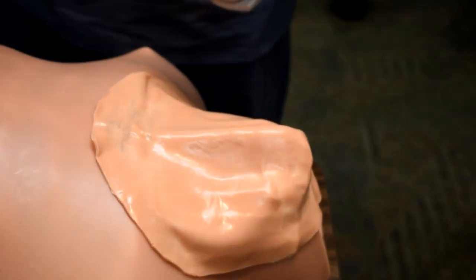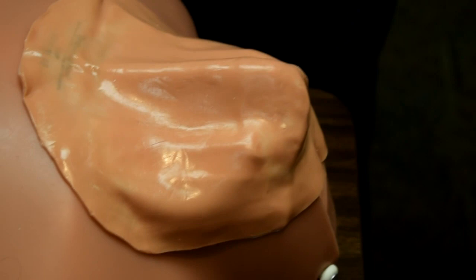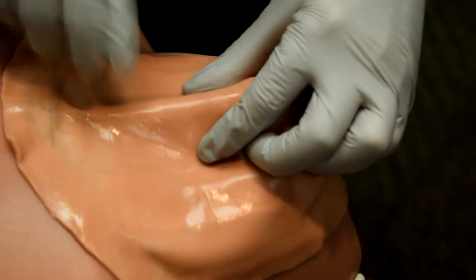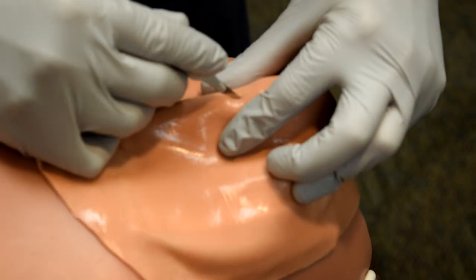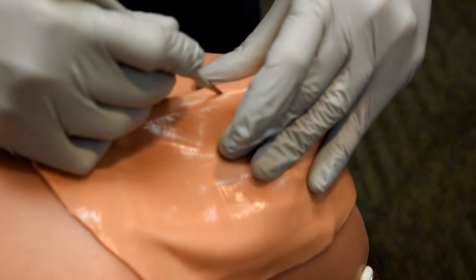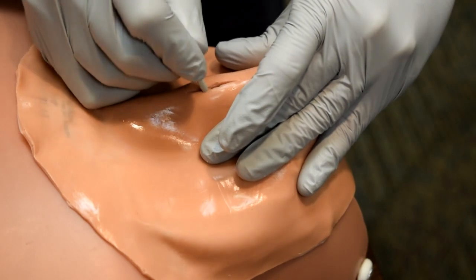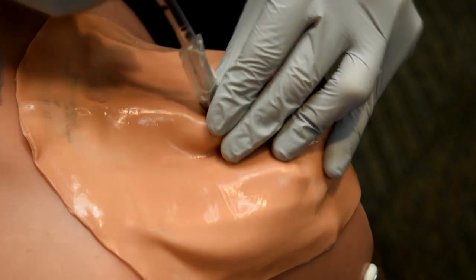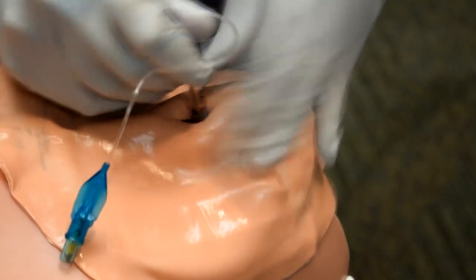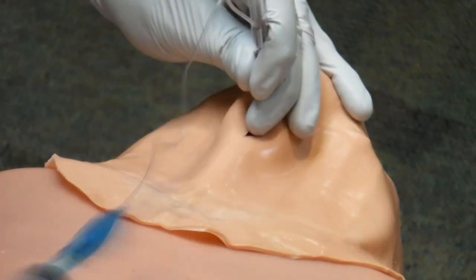Again, I am a right-handed surgeon, so I'm going to approach the patient from the right side. This is a surgical emergency, so I'm going to use my two hands. Left hand is going to feel my anatomy and stabilize, sternal notch, bump, bump, space in the middle. I get my knife, and I'm going to cut vertically, feel, cut, feel, cut, I feel my cricothyroid membrane. I get the knife in, turn it horizontally. I get through the cricothyroid membrane. I use my finger to dilate, and I'm going to insert the endotracheal tube until the cuff is just in. I'm going to inflate the cuff. I'm going to hold on and attach it to a ventilator or to a BVM.